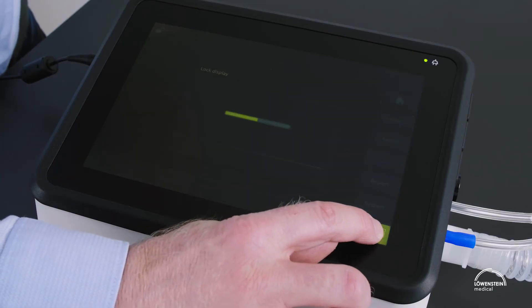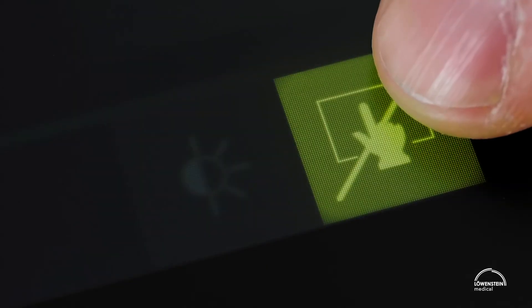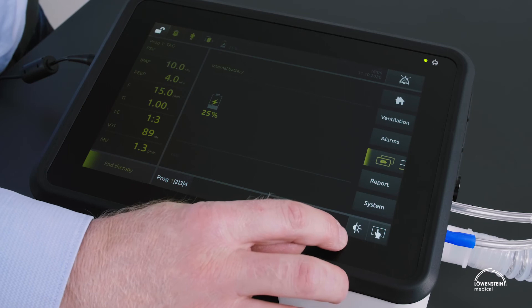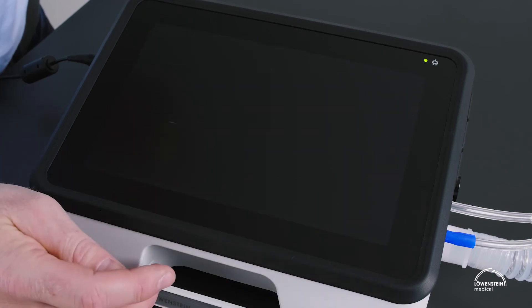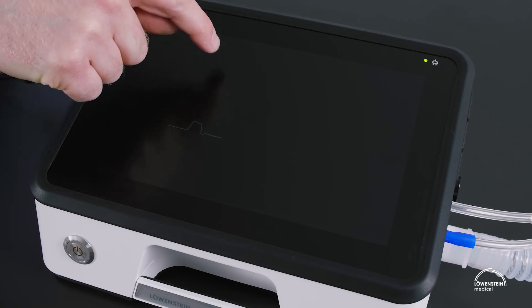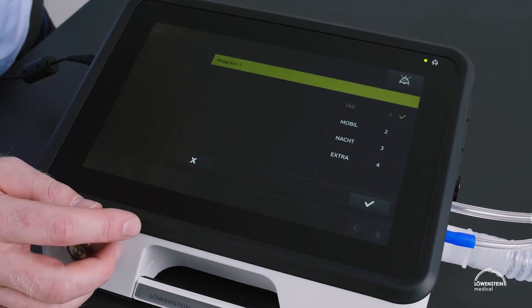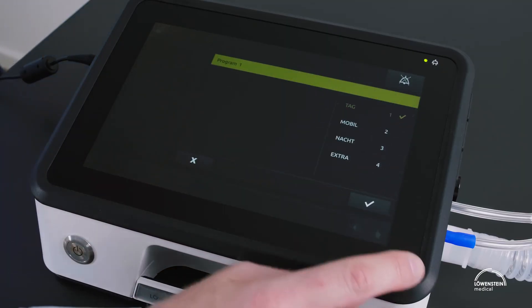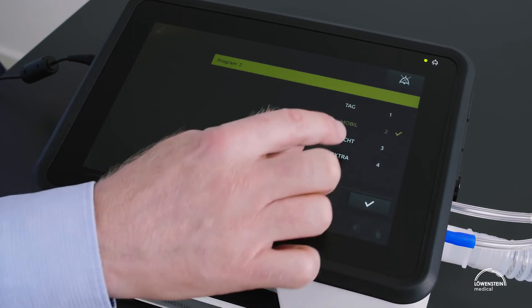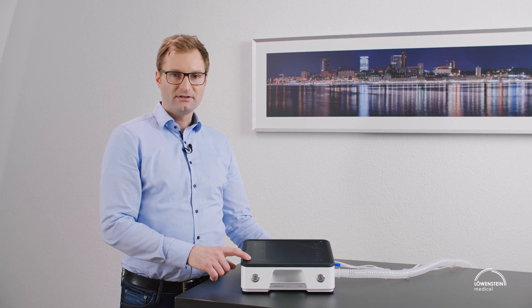On the lower right, the touch lock is placed in case the device needs to be cleaned. Next to it is the key to access the night view or the quick access of the brightness settings of the display. When more than one program is released for use, we can change the program directly with this button. Start and stop of therapy is done here.